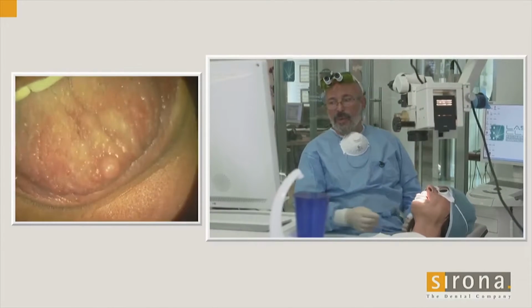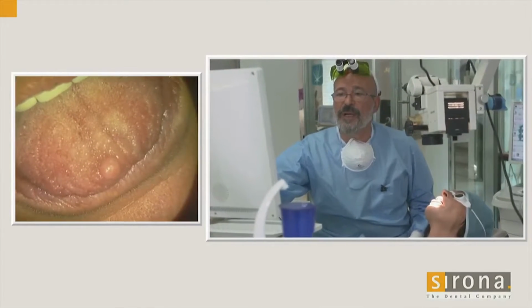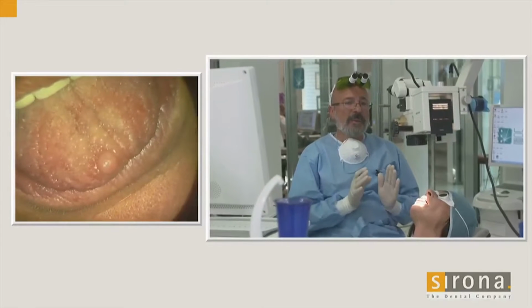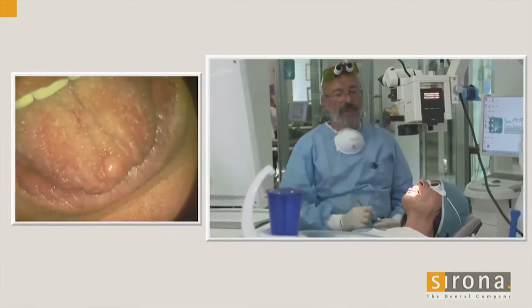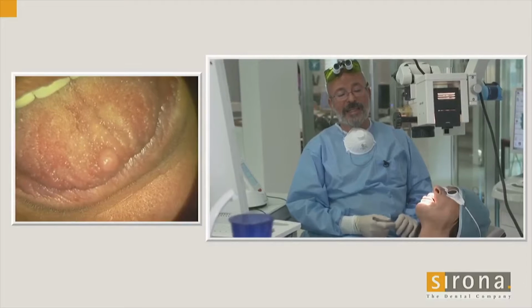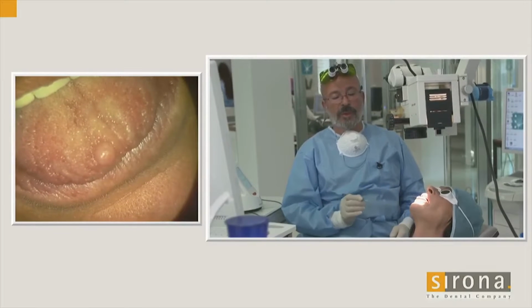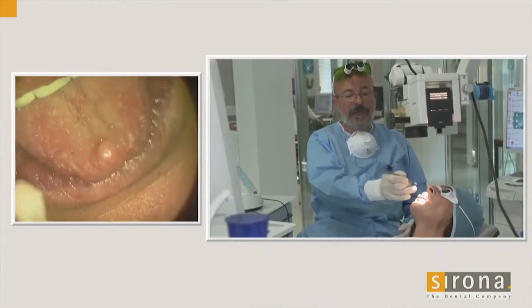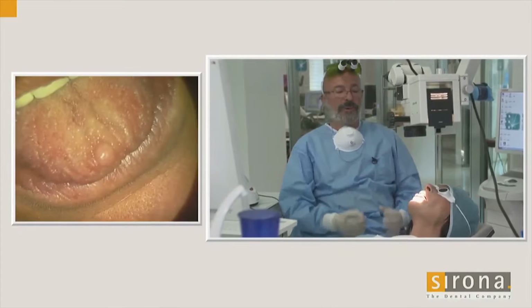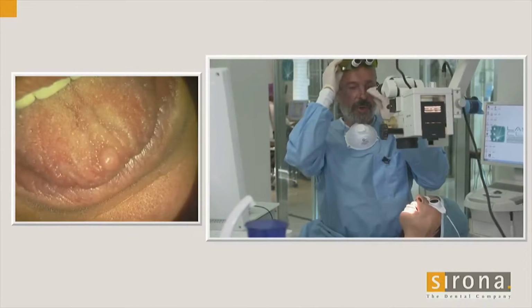And we will use the 3 different wavelengths of this laser in order to give the minimum energy to the surrounding tissue, in order that the histopathological analysis will be sure without any possibility to consider any burning finishing line or margin. So it's very important not to burn all the tissue, but to do a perfect excision of a lesion. So we are ready to start.